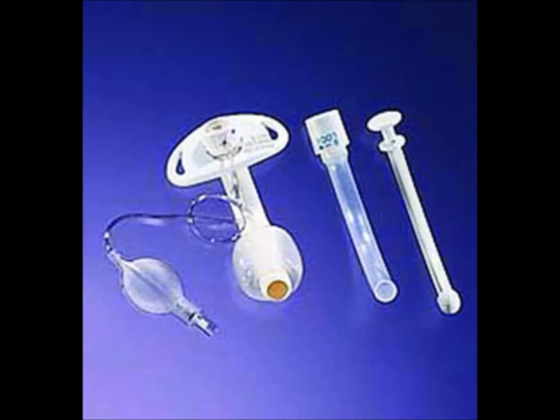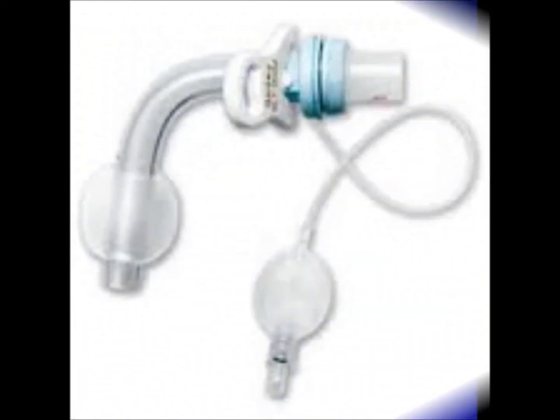Other parts of this tracheostomy tube include the outer cannula, which is the trach tube itself, all the way to the left in the picture, the inner cannula, which is the one in the middle, and the obturator on the right. The inner cannula allows for smooth suctioning. It is disposable in this example and locks into place. The obturator is used for the tracheostomy insertion.